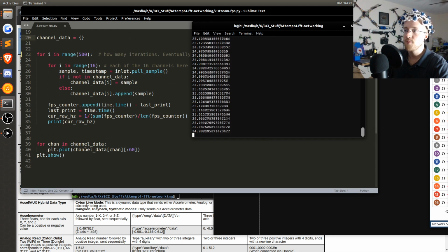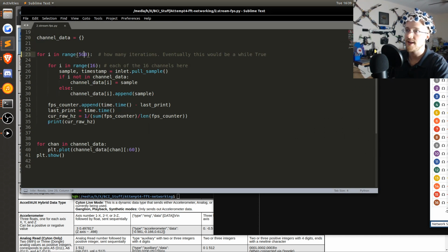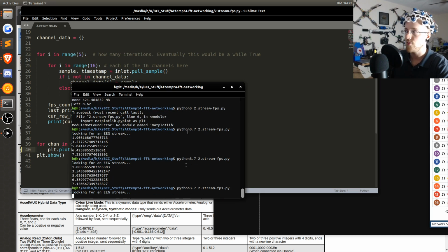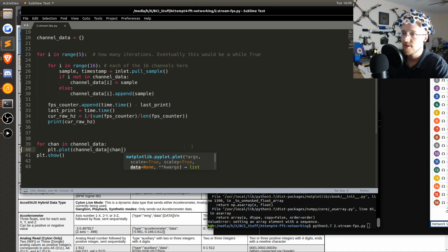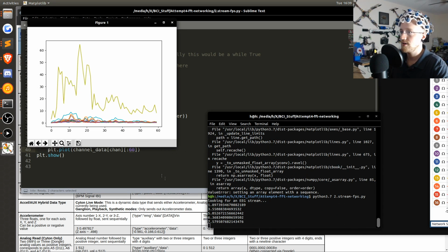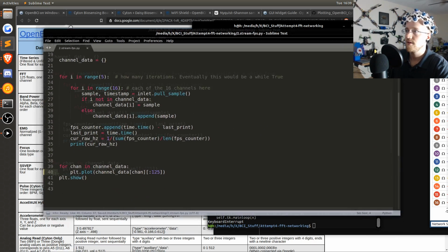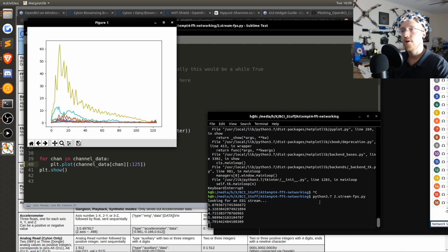And then here, I'm just plotting the data channels up to 60 hertz. So we actually have more information, right? So what we could say is, let's go back to 5 and just plot the whole thing. We actually have data all the way to 125 hertz. Possibly. Why? Actually not sure why that is angry at me. Why are you angry? Huh. I don't know why it got angry at me there.